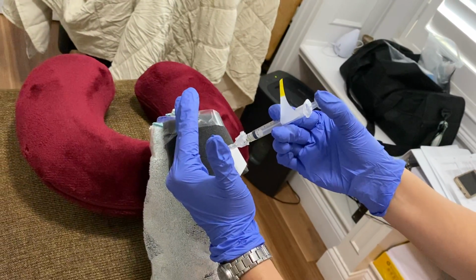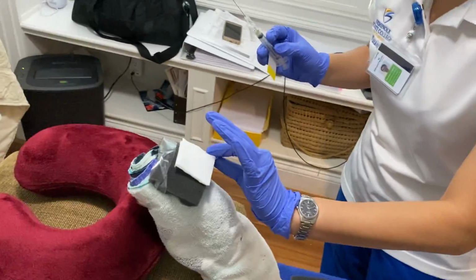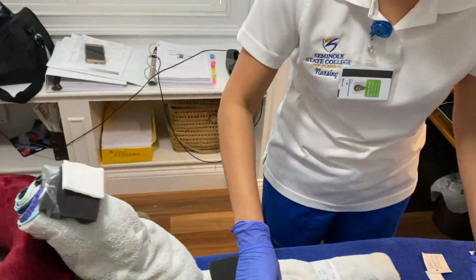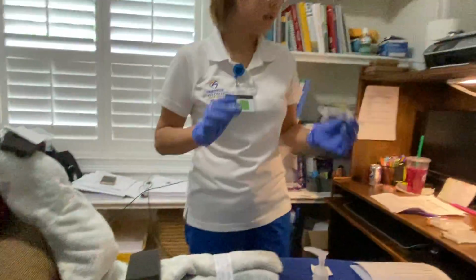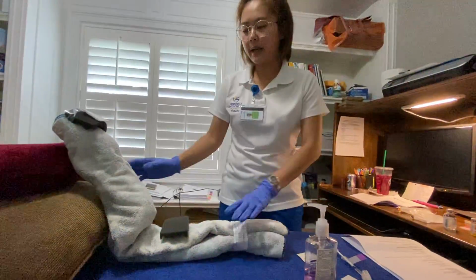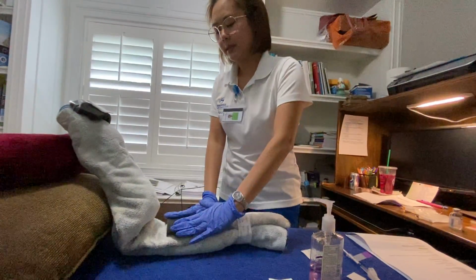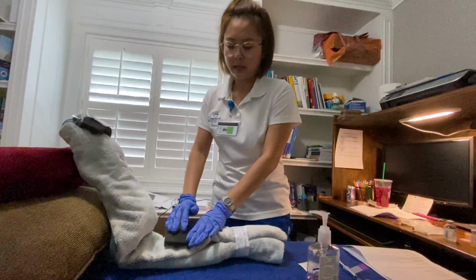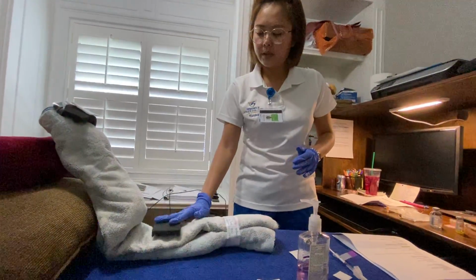All right, pull it out. And then cover with the gauze and don't massage. Then we scoop with the, okay, put it in a sharps container. Is it okay? All right, I'm positioning the patient in supine position to give the sub-Q in the abdomen area here. So that's it, it's good, relax.